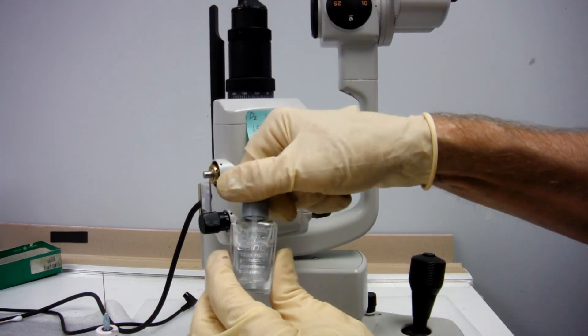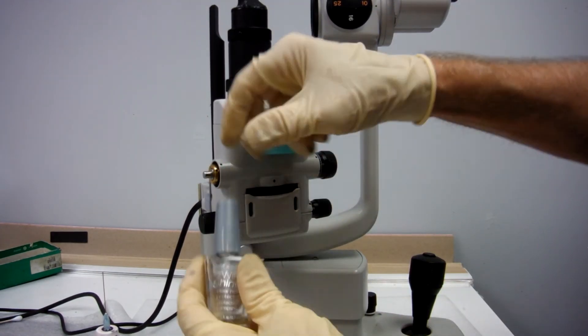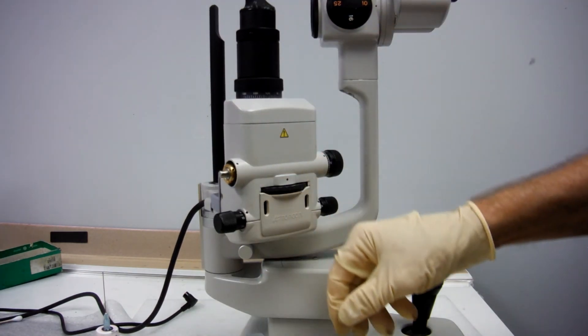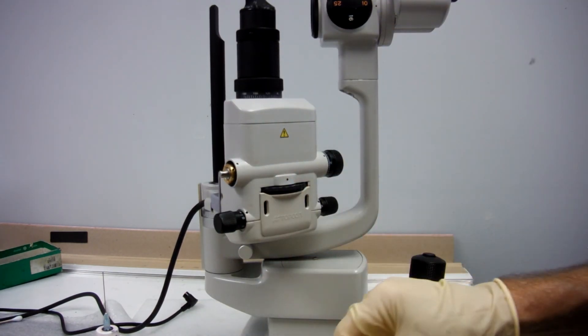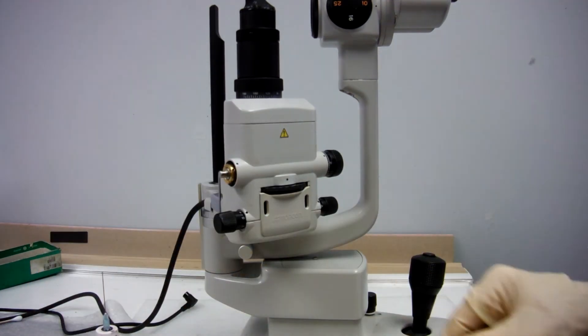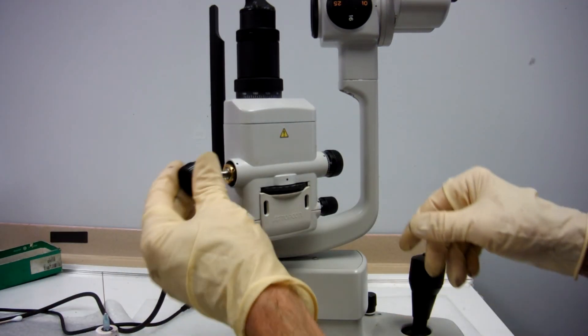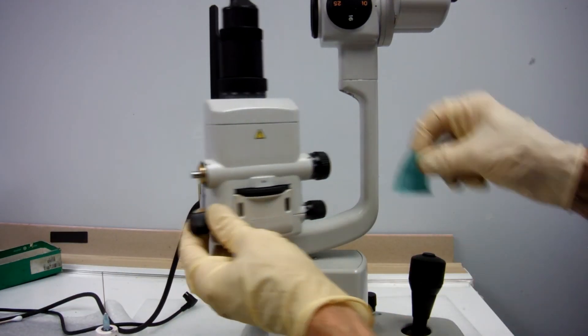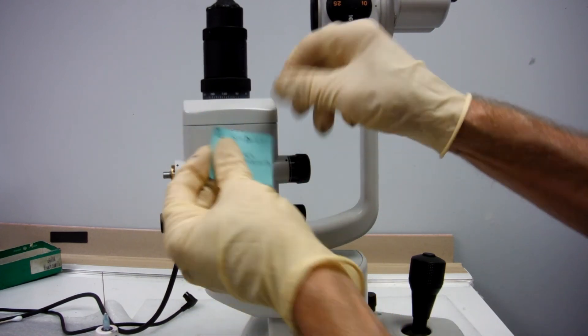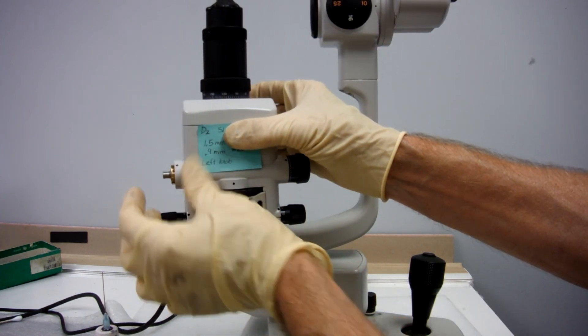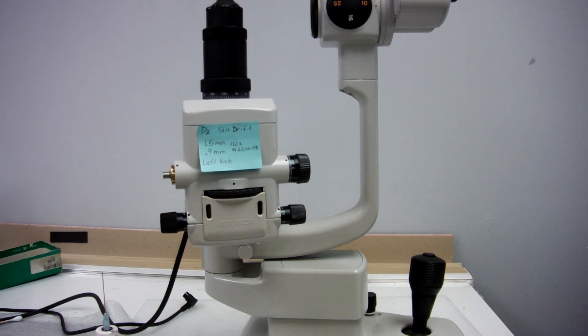You might want to put a little fingernail polish in there to keep it from coming out, and you can put your knob on. So there you go.